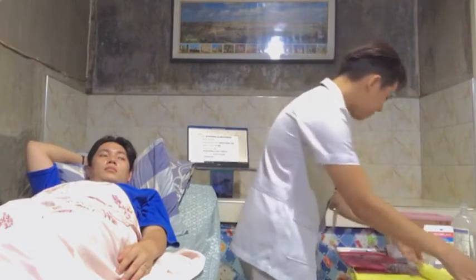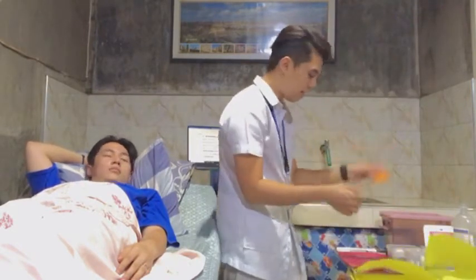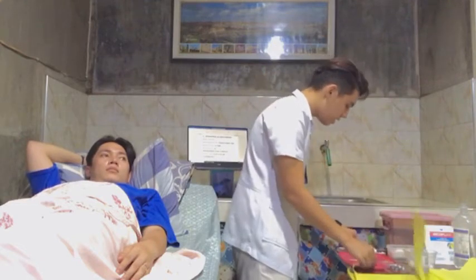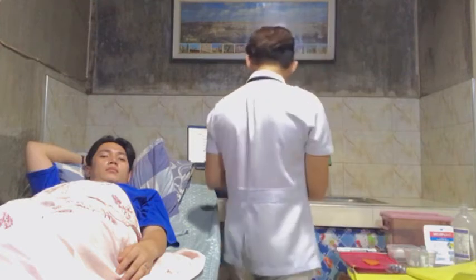Of course, after that, prepare the medication tickets beside the injection or the syringe, and then we can now have our second safety check.